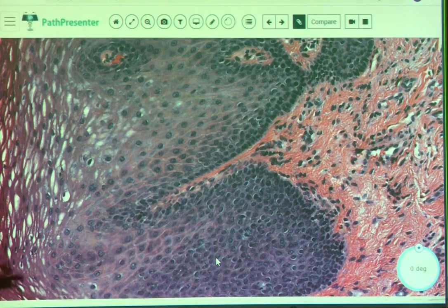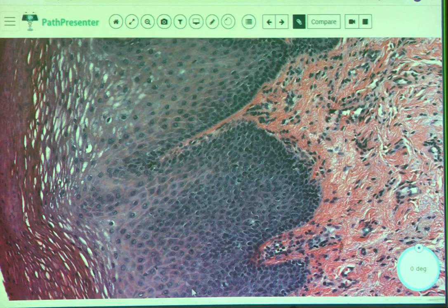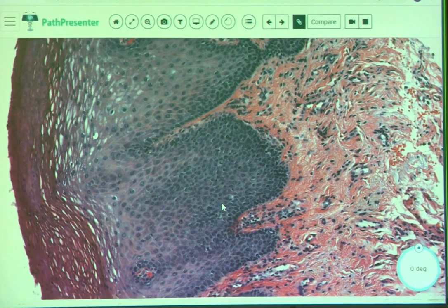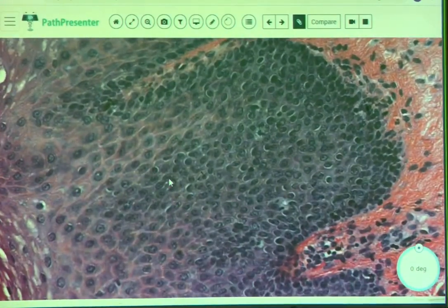Right. And yes, it is definitely hypercellular, so you were way ahead of me on that. And it is somewhat haphazard in its arrangement, but it looks really different to something that's right beside it, right? Right, yeah, so it's very focal changes. Yep. And it doesn't look too scary, right? It's a little unusual, but it doesn't look too scary.